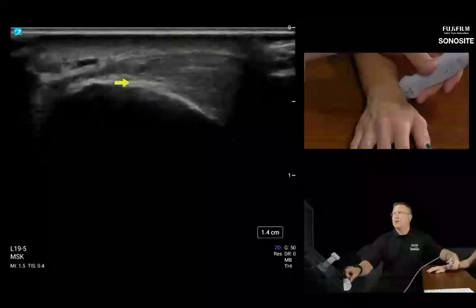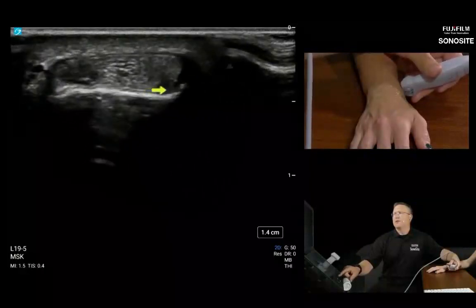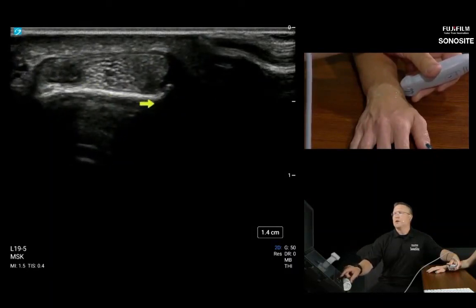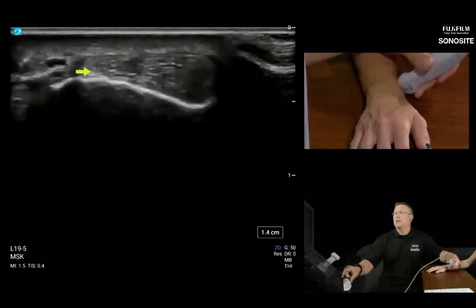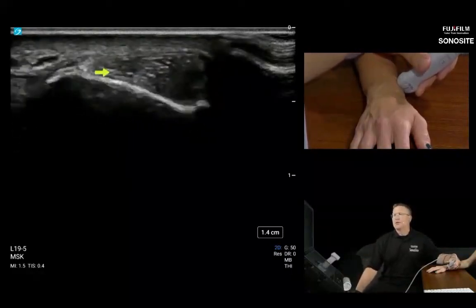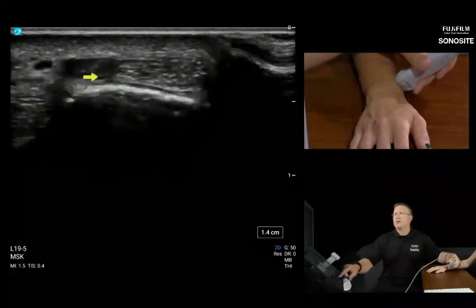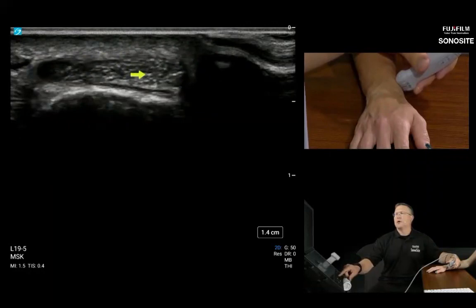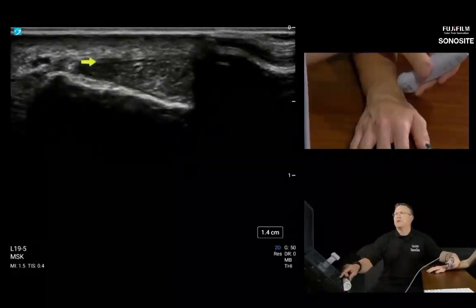So we can see a lot more in the image than we did before. We can still see the prominence of where those little retinaculum begin. So here's that retinaculum over compartment 1. So this is the APL, and here's the EPB. And you notice there are 2 separate and distinct tendons going 2 separate and distinct directions. So if I tilt the probe ever so slightly, you'll notice the EPB changes its anisotropic property a little sooner than the APL. Just a little tilt there. So the EPB really shows itself pretty quickly.